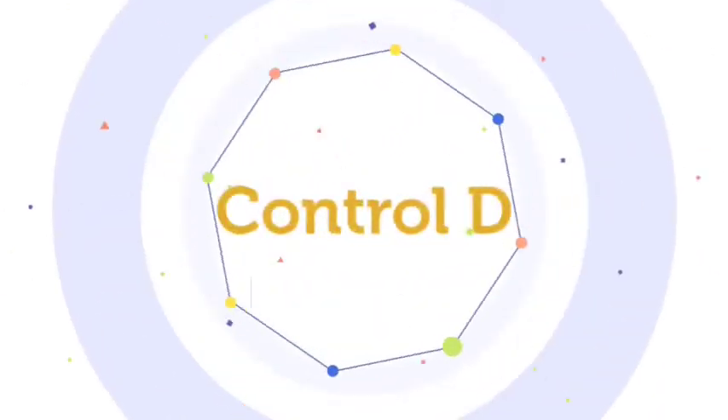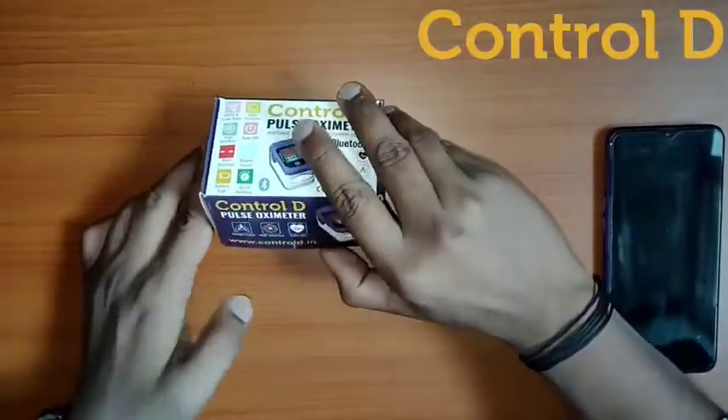Control D presents the Pulse Oximeter. It is a device which measures your SpO2 readings.